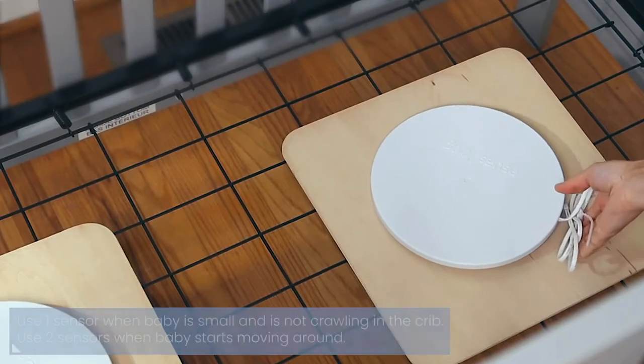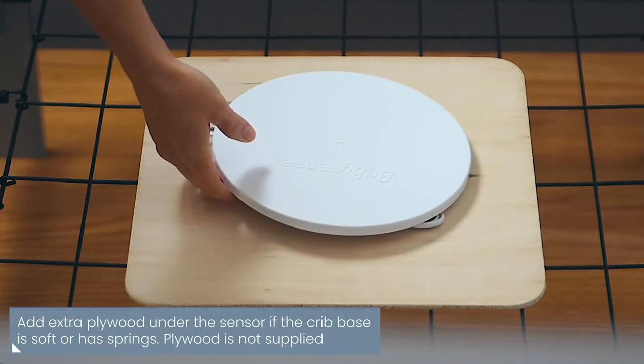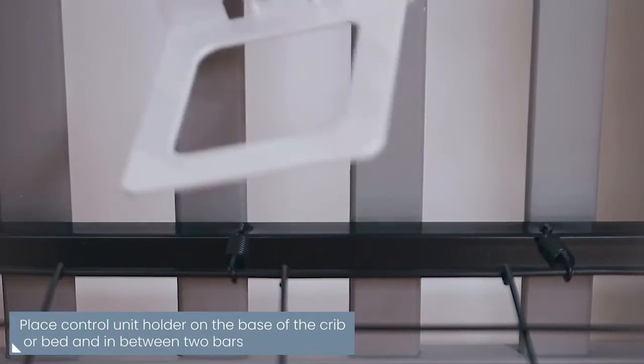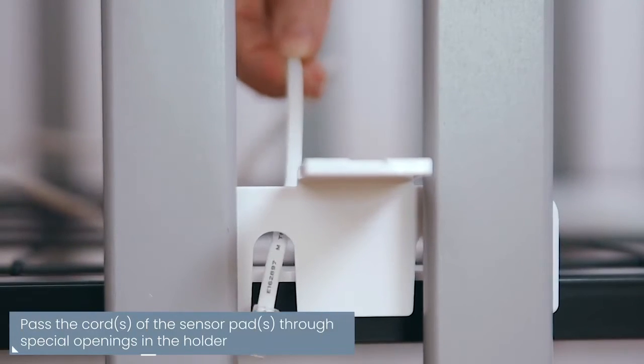When using a crib with a soft or spring base, add plywood under each sensor to ensure proper contact with the mattress. Place the control unit holder on the base of the crib and in between two bars, then pass the cord of the sensor pad through the special openings in the holder.